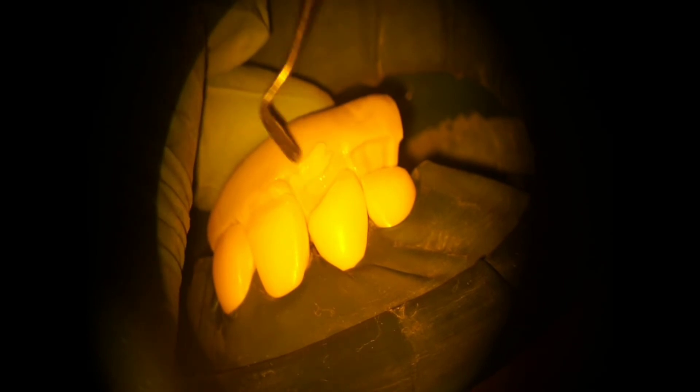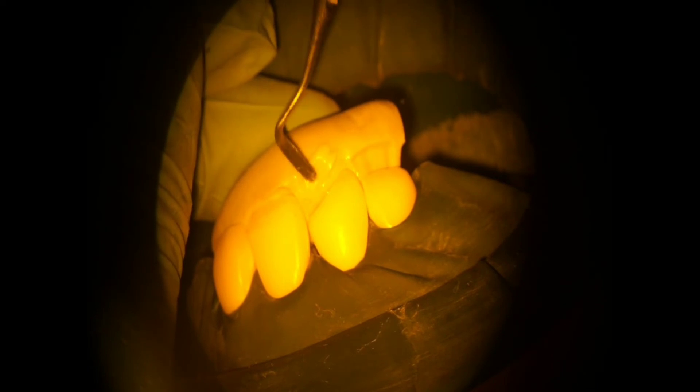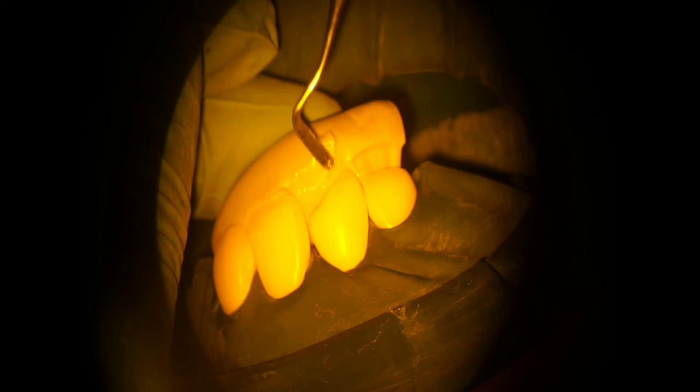I am using a blue face power cure light here. Then with the help of this putti index we will make a palatal shell with the chosen enamel composite which we choose.